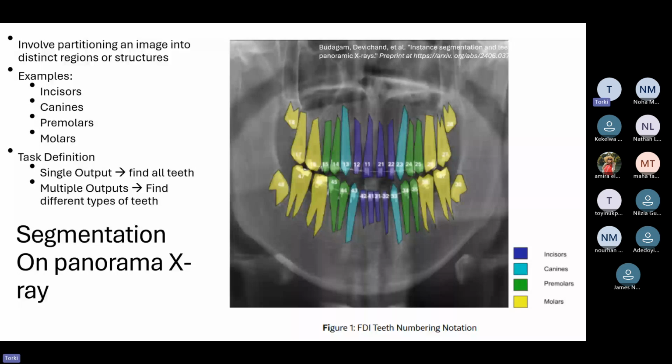Most of the time we use models that use maybe 500 by 500 or even 800 by 800, no larger than this. So in this sense, I know from my expertise that the original image resolution is much higher than that. So it is okay to reduce the image quality, but not too far. Don't make it 100 pixels by 100 pixels. This will be a disaster. But 500 by 500 is good enough for many deep learning algorithms.